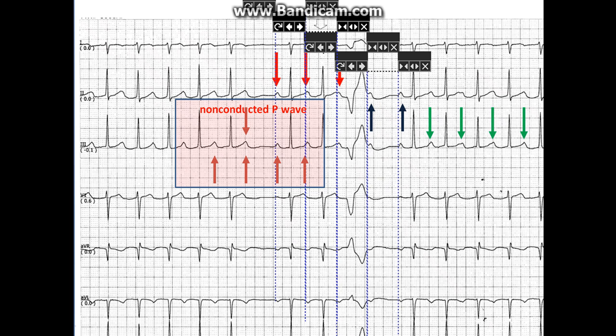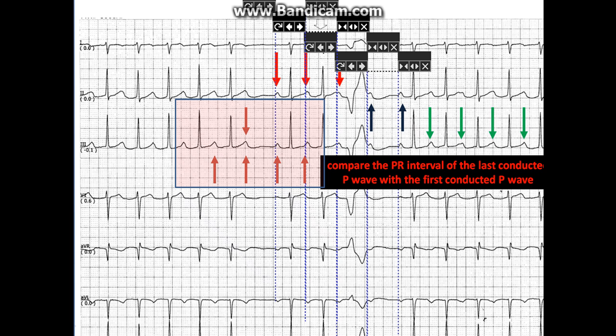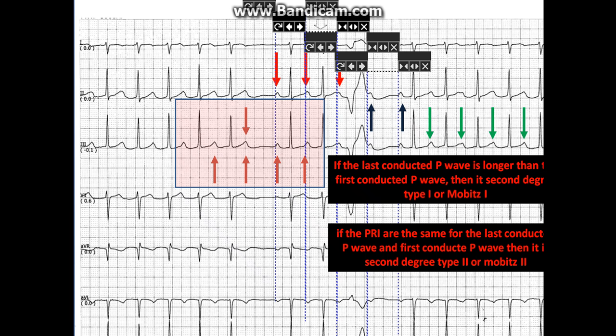What is this block? A simple way to know whether this block is due to second-degree type 1 (Mobitz 1/Wenckebach) or type 2 (Mobitz 2) is to compare the PR interval of the last conducted P wave with the first conducted P wave. If the last conducted P wave's PR is longer than the first, it is Mobitz 1. But if the PR intervals are the same for the last and first conducted P waves, then it is Mobitz 2.